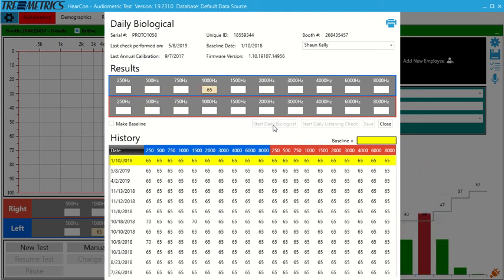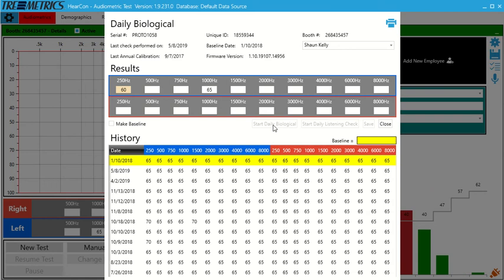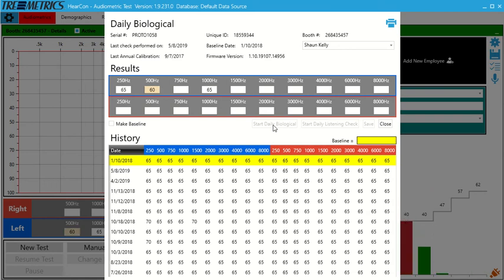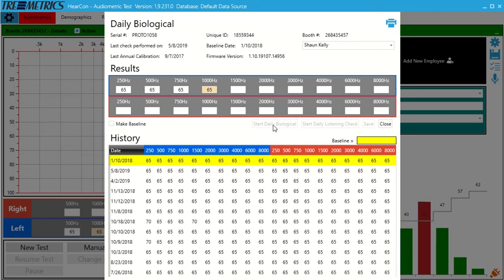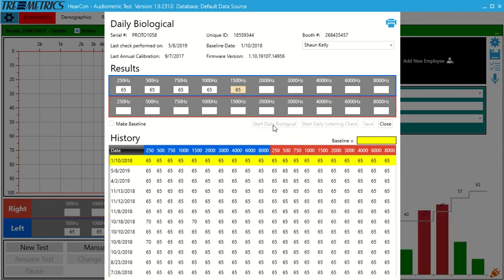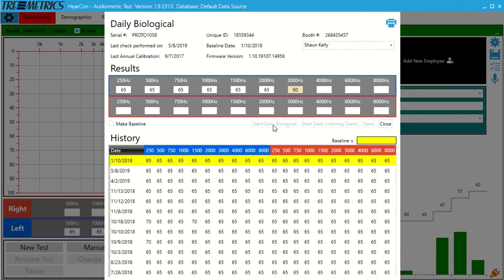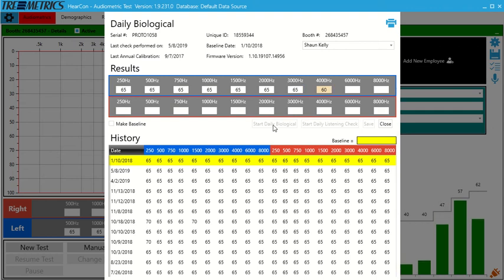So the daily bio is typically going to finish in about 45 seconds. So it's very quick. The Hercon software is going to hold all results. You'll be able to pull reports either for an individual day or a history of the audiometer.